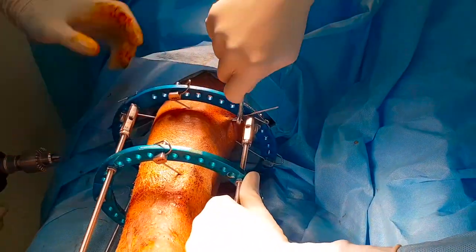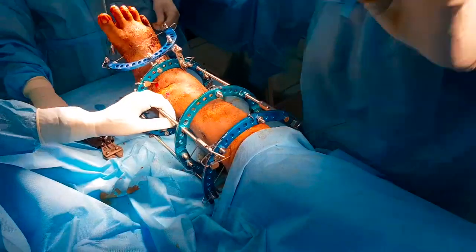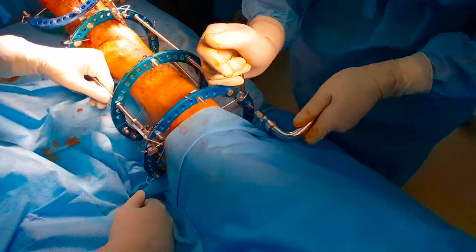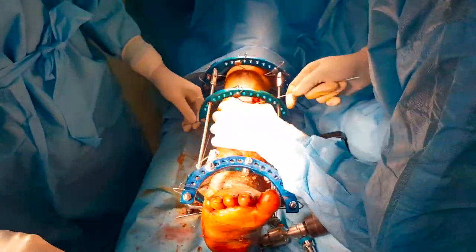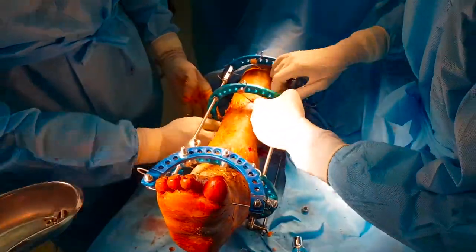The third wire is now passed in the proximal tibial ring through the safe corridor and tensioned by the Russian method of tensioning. The next wire is the perpendicular wire in the middle fragment.